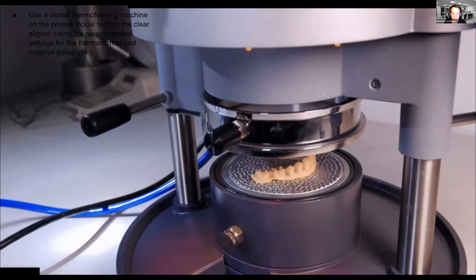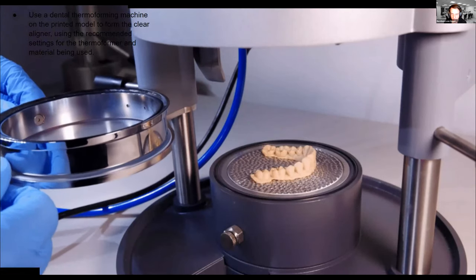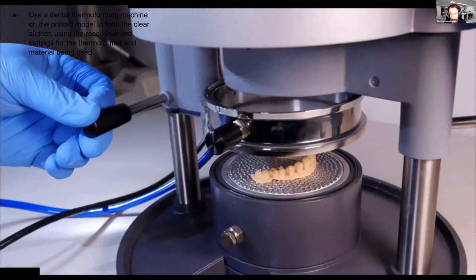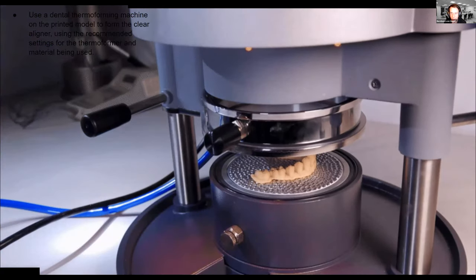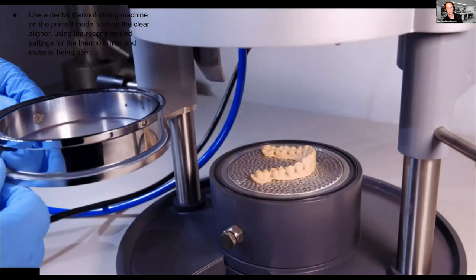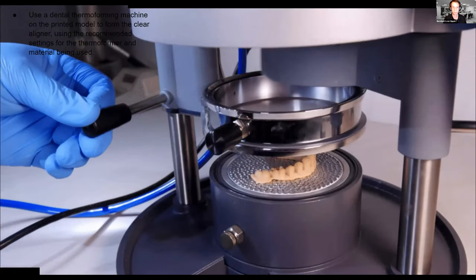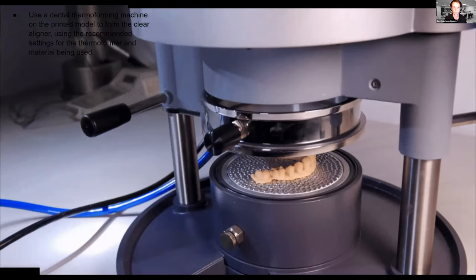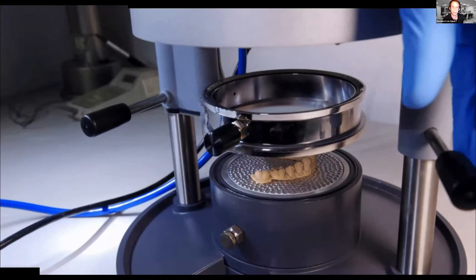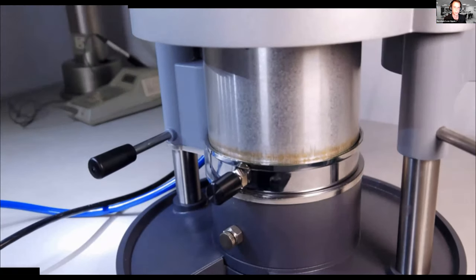Some of these machines are operating on pressure, some are operating on vacuum. And they basically heat up the sheet, and then it is pressured or sucked down on the model. You will have to fix the sheet in a special jig that you then swipe in and put the heat source above it. Once heated up, you remove the heater, and the sheet then is pressed or sucked down onto the model.